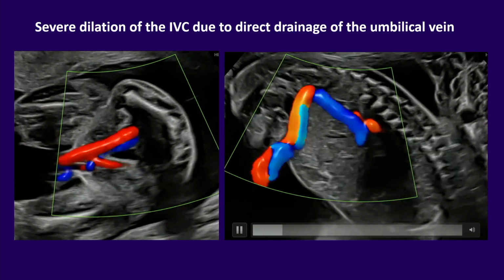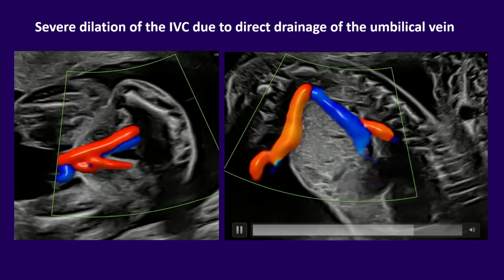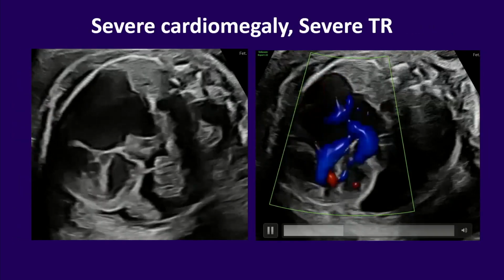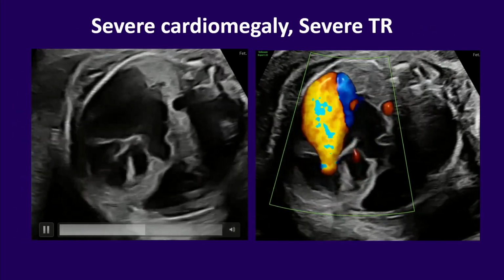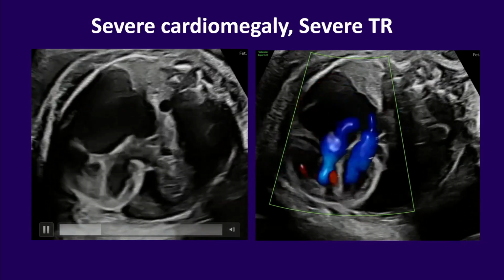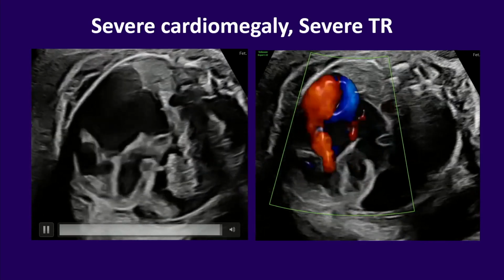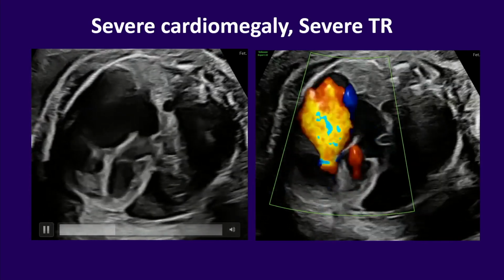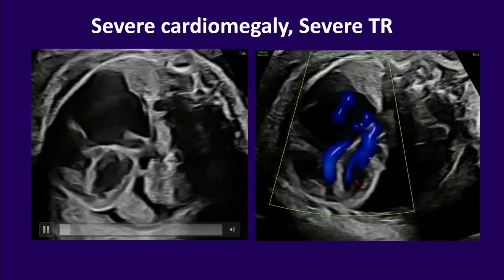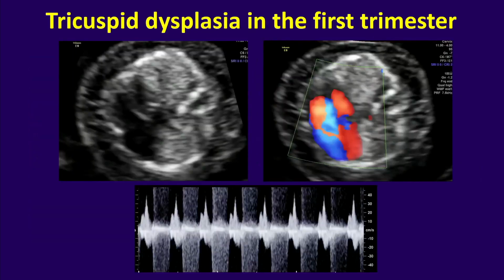So in this case, we have agenesis of the ductus venosus, an extrahepatic course of the umbilical vein that basically causes the volume overload for this heart, and this is why that tricuspid valve has such a significant amount of regurgitation. Over time this develops into a really bad, non-survivable situation, because in the third trimester this is all that is left of the lung tissue for this baby, so appropriate counseling should be provided here.